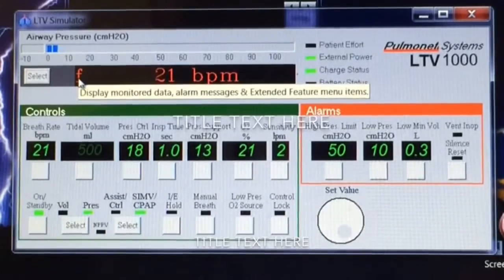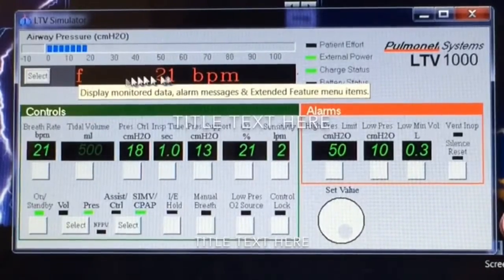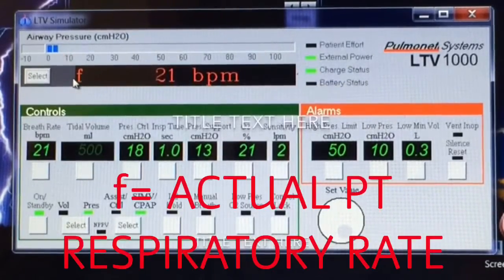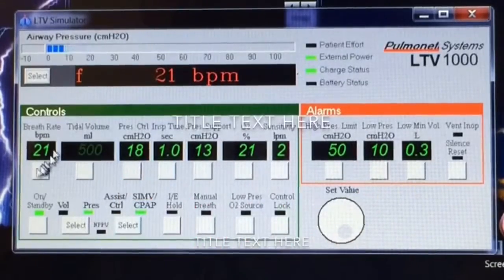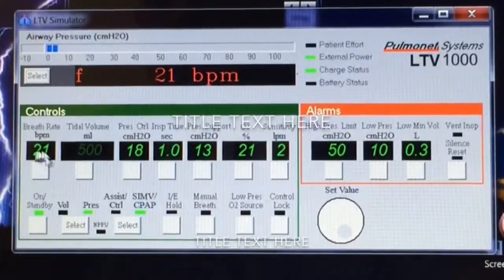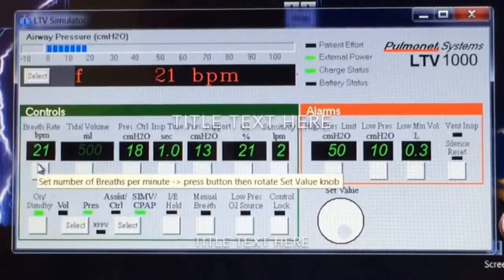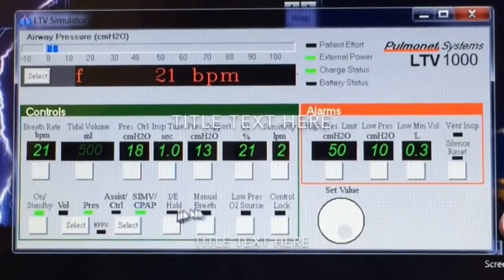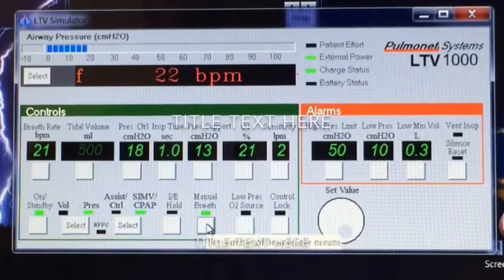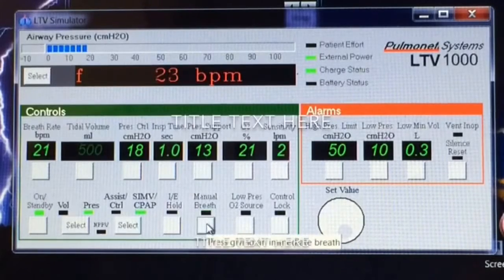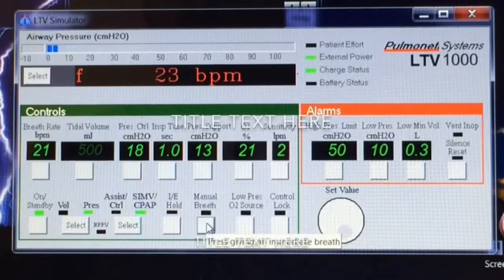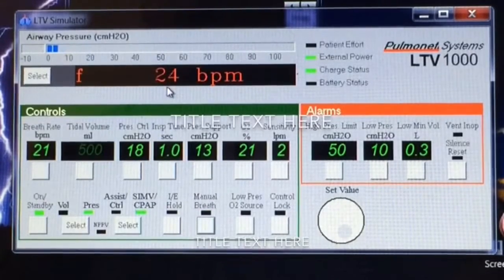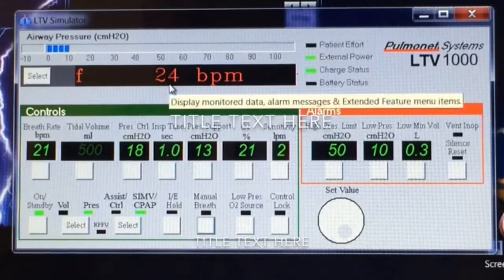The F is the frequency of breaths — that's their actual breath rate. Now, down here it shows what the ventilator is giving in the breaths, but if they're taking a couple extra breaths, some spontaneous breaths, it will show you the patient's actual breath rate.